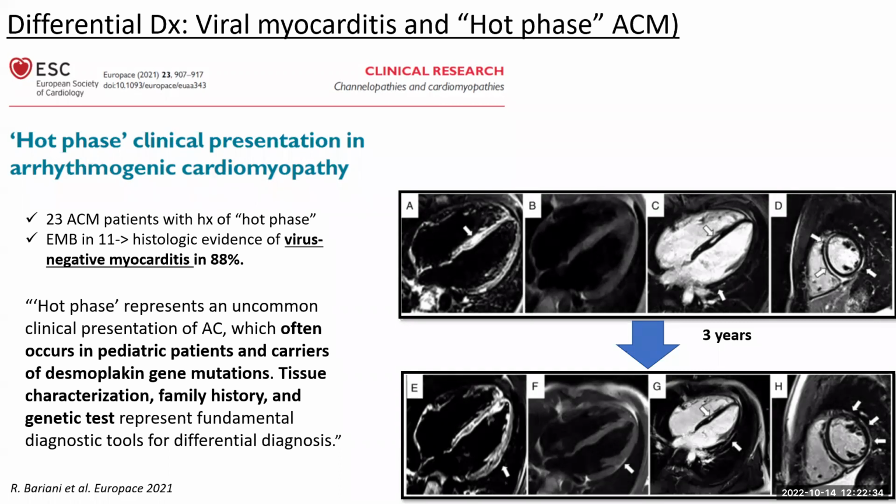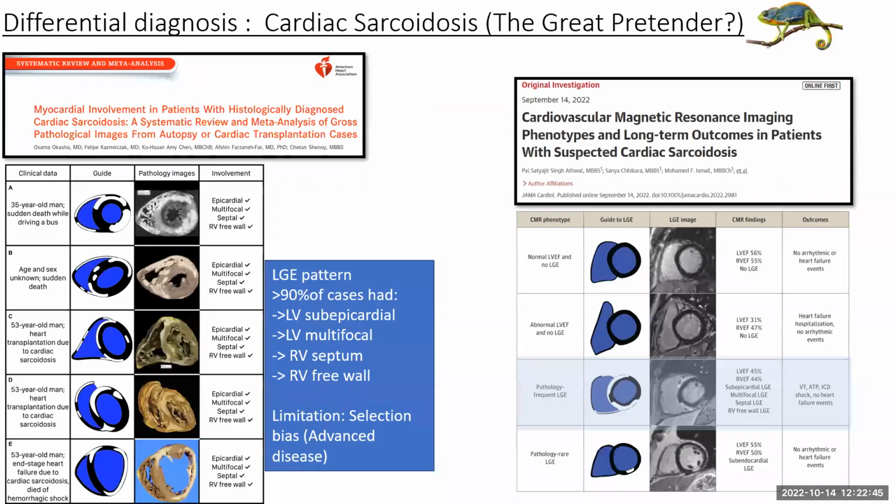acute myocarditis LGE tends to become less prominent in the follow-up, as opposed to cardiomyopathies in which fibrosis often progresses or stays the same. An important differential, of course, is sarcoid. This disease shares, perhaps with ACM, a common clinical picture regarding myocardial scarring with dilation and dysfunction leading to ventricular arrhythmias and heart failure.